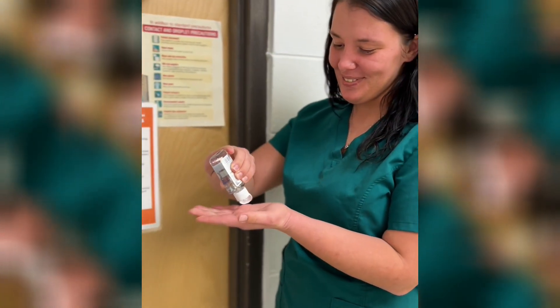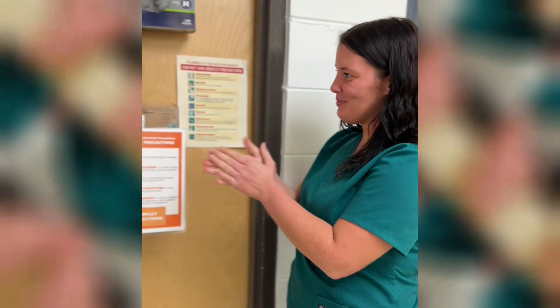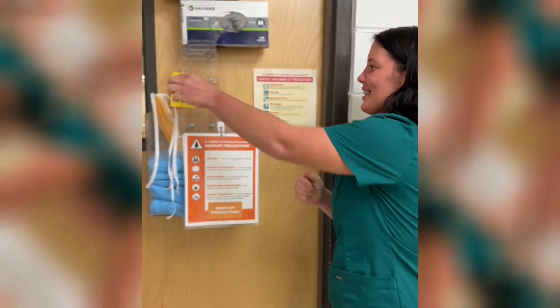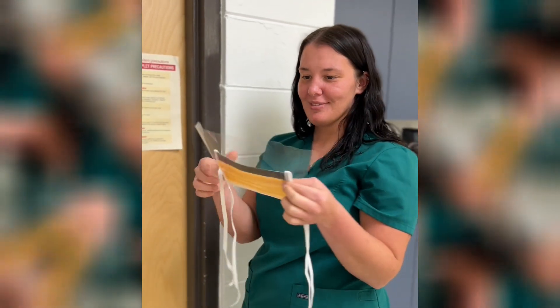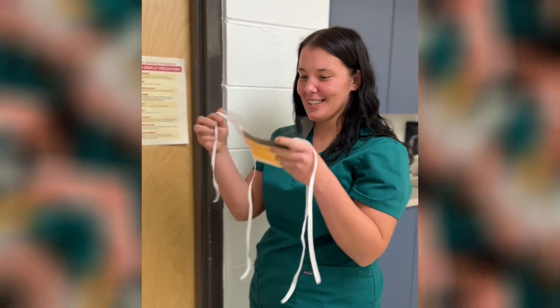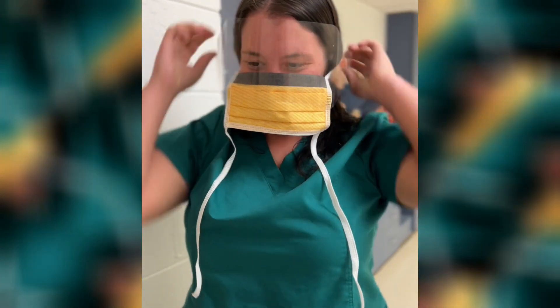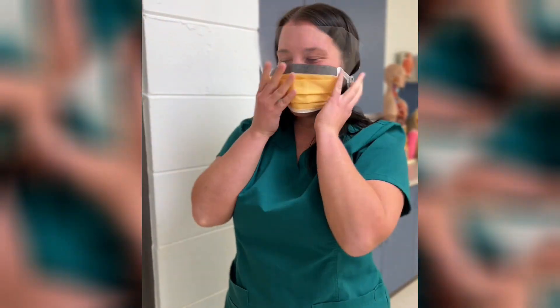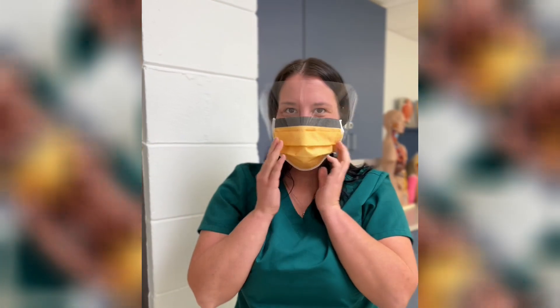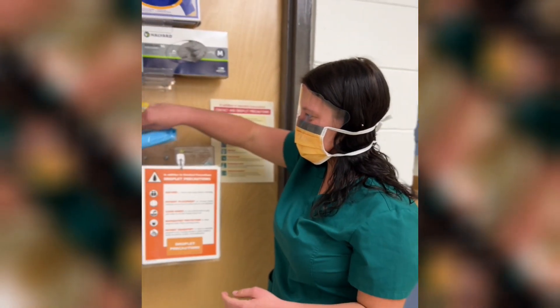The first thing you want to do is put your hand sanitizer on to get your hands clean, just rub it in. Then you're going to put your mask on. For droplet precautions you're also going to need your face shield so nothing gets in your eyes. Once you get your mask on, you're going to get your gown.